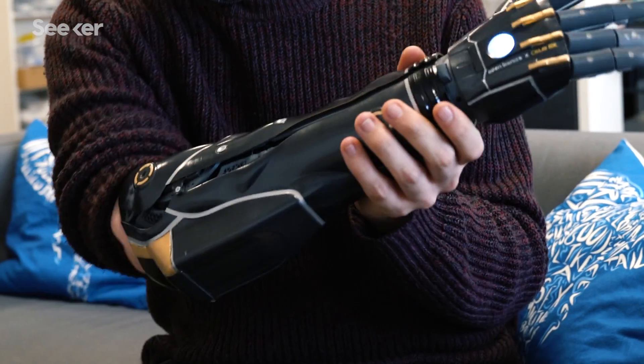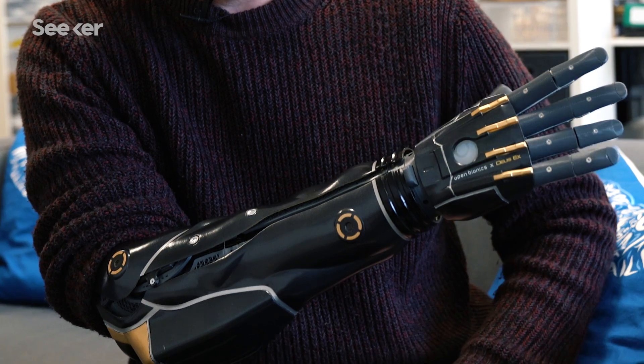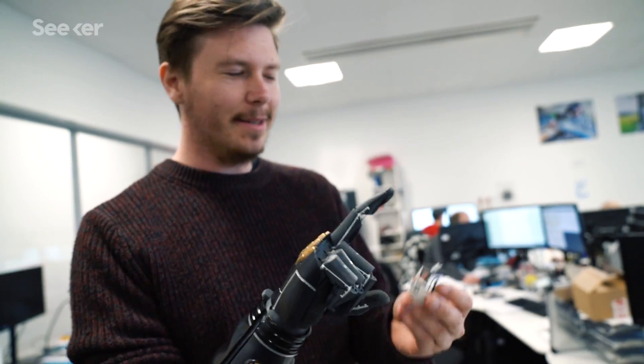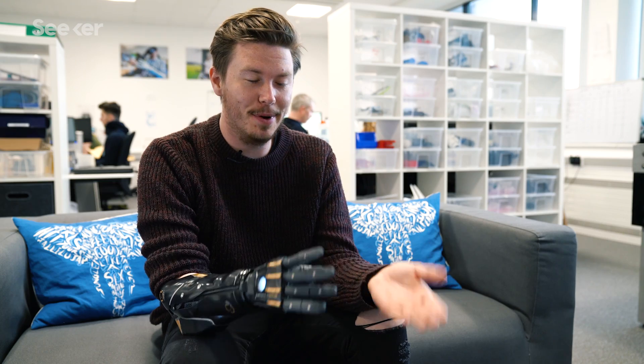It's just gotten better. At first I thought it just needed to open and close, but actually being able to pick up more dexterous items, or even something heavy — holding a tray, opening a door, opening a bottle of water — that's a major thing.